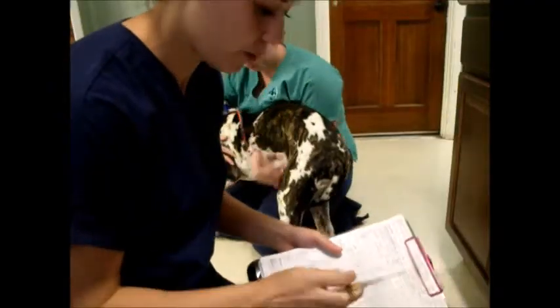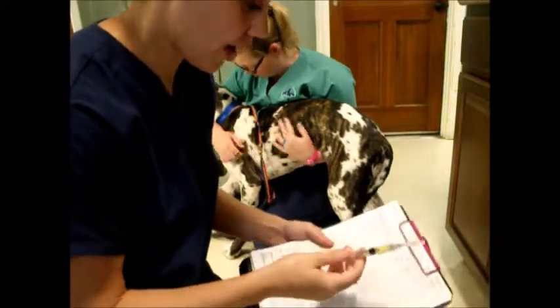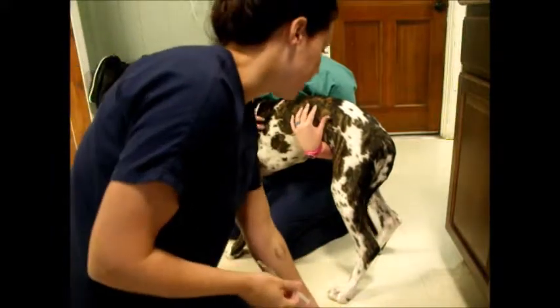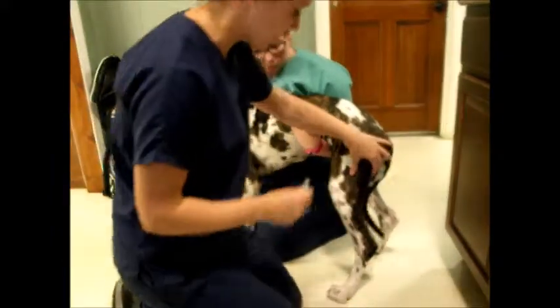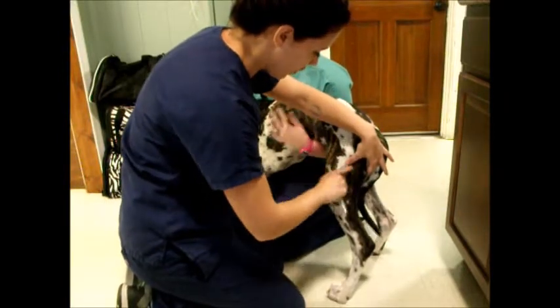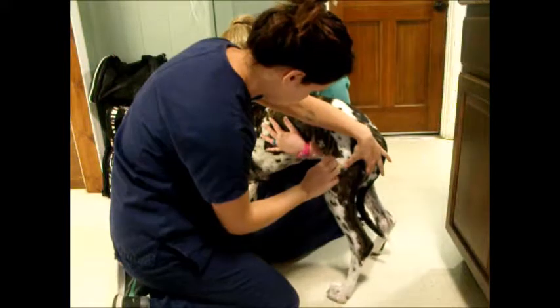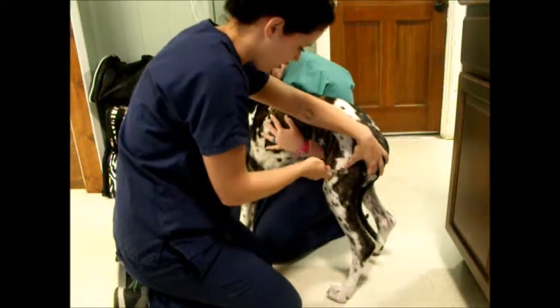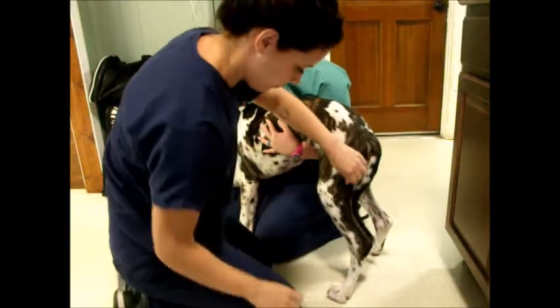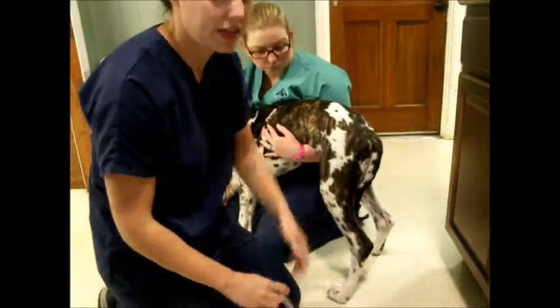Okay, so now we've got our pre-med of ace, atropine, and torb pulled up. So that all comes out to 1.4. There's no air bubbles. So now I'm going to go ahead and pre-med Harley here. I'm going to do this in the semitendinosus muscle back here. So I'm just going to isolate, and then I will poke backwards so I don't hit that sciatic nerve. Draw back for no blood. Okay, so now we'll go put her in the kennel and let her pre-med take effect.